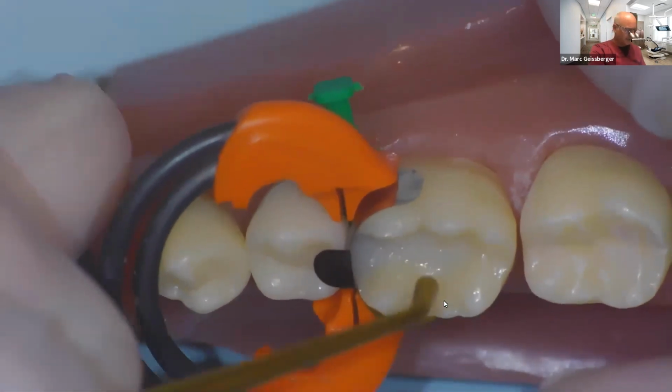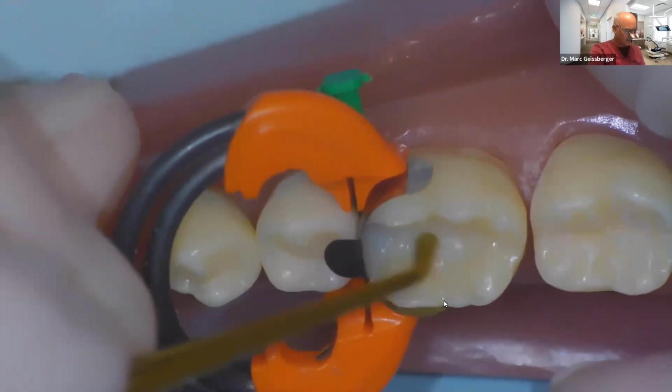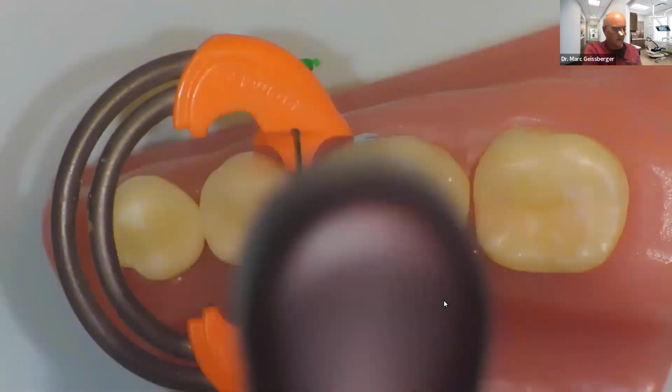Now, people ask all the time, I get voids in incremental layers. I said, here's what happens. You get voids because you're probably over manipulating the material, or you're not burnishing it as you go. You may want to employ the use of a resin blend from Clinician's Choice. I've got that at the end of the instrument, which smooths this off super, super nicely. So I'm giving that 10-second cure. And as soon as that goes off, now I'm going to go back to the box form. Okay, so all cured.